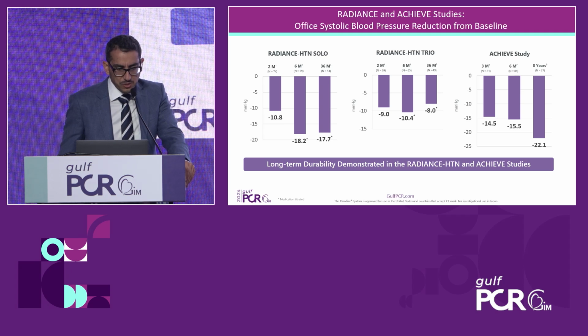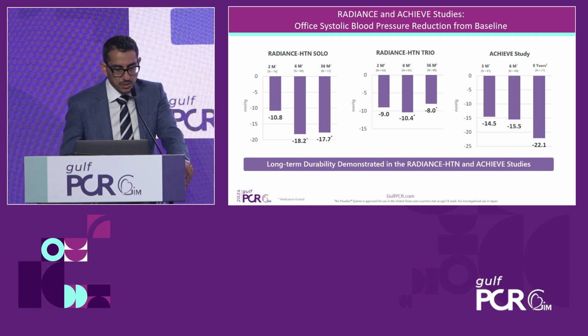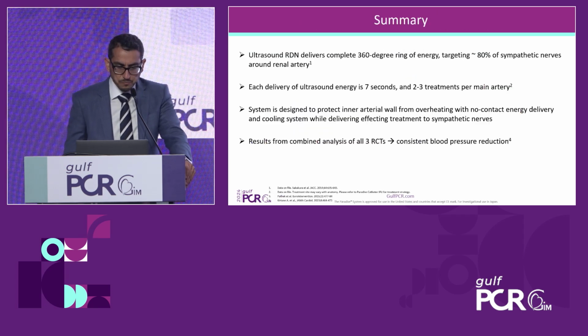And what we see here is some long-term data in two of the randomized trials, and one single-center study shows even data out to 8 years with persistent reduction in blood pressure. So of course, this should translate into a reduction in cardiac events.